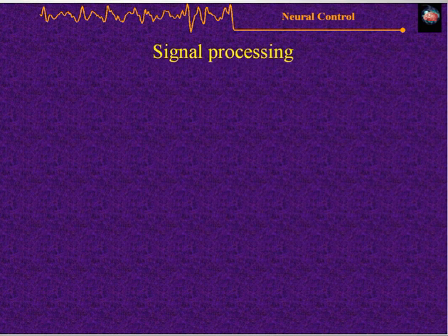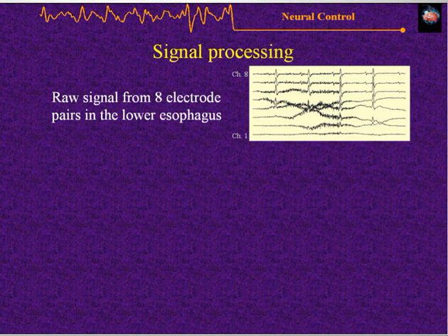Now, neural-controlled mechanical ventilation is successful because of the signal processing. You can see it's not very pretty, the 8 signals that come out of our electrode array. You have contamination from the cardiogram here, as you see. Oh, by the way, this is one inspiration from FRC to TLC. You also have a significant amount of motion artifacts that contaminate your signal.